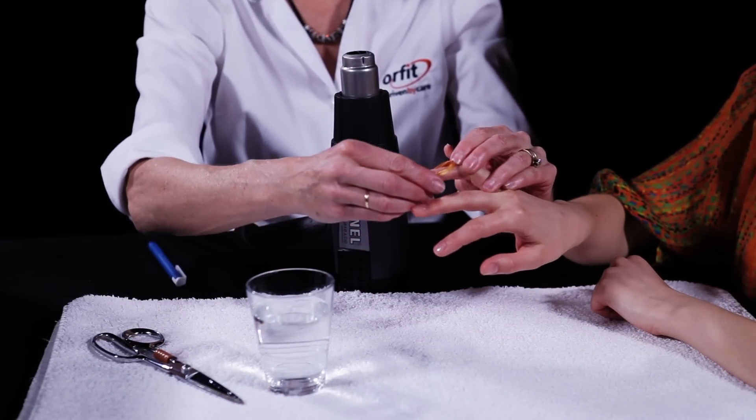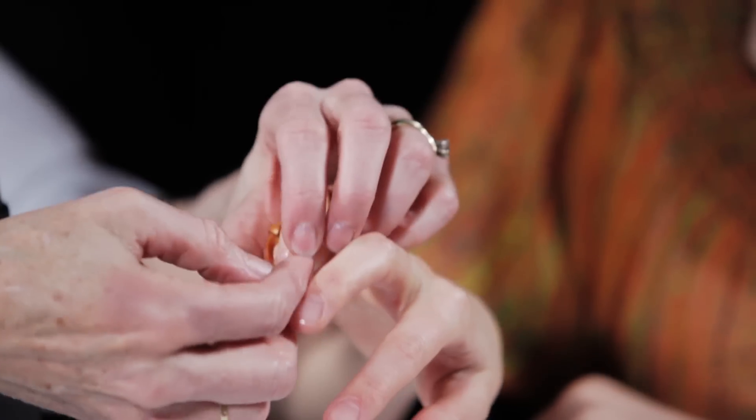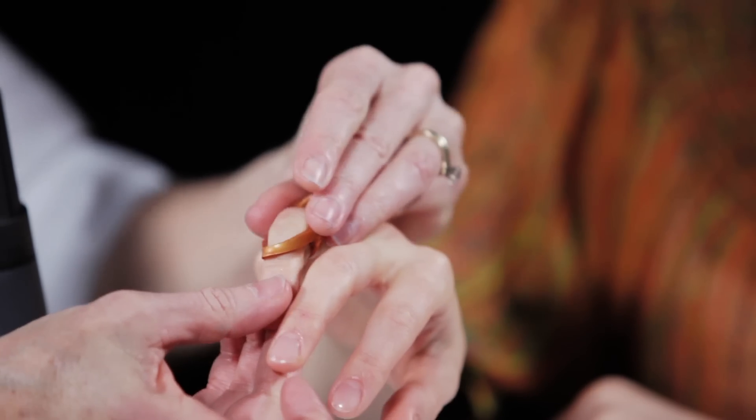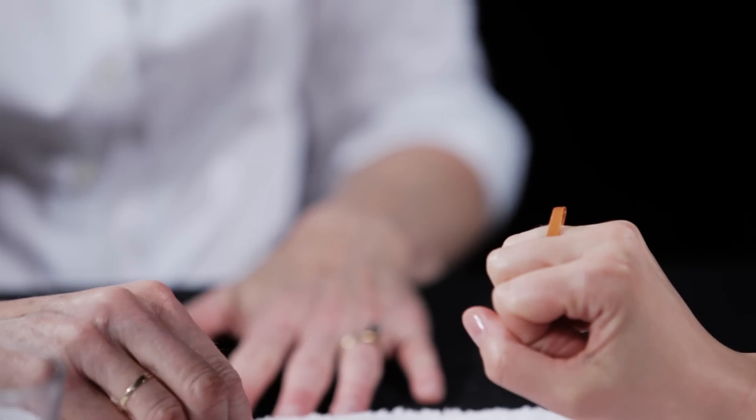Slide the orthosis over the flexed finger. Check the fit and effectiveness of the orthosis by asking the patient to extend and flex the finger. The orthosis should prevent hyperextension of the PIP joint while allowing full finger flexion.